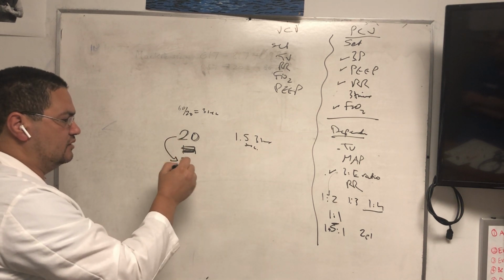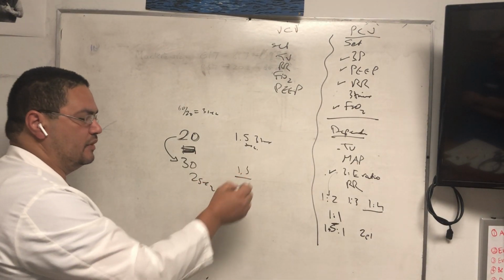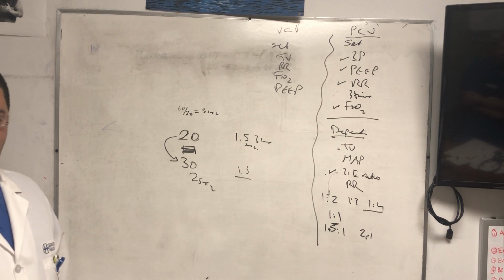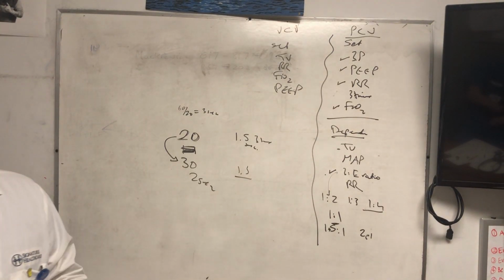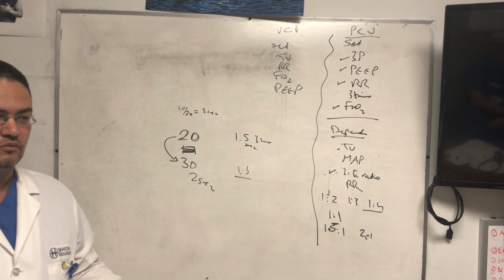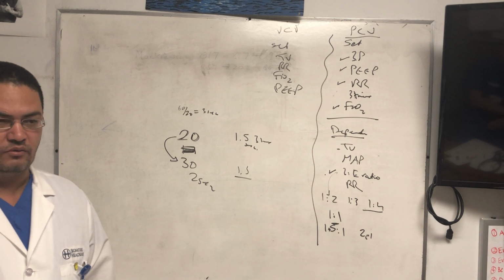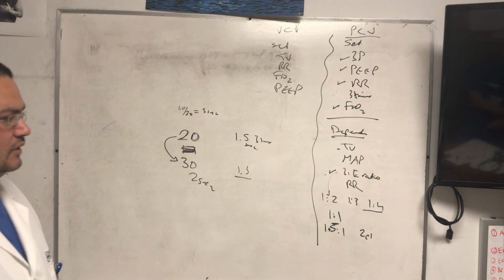If the patient goes to 30, breathes at 30, what's going to happen? He now has 2 seconds per breath. 1.5 of them will remain I time, and only half a second will be for the E time. So the patient will have auto-PEEP, pop his lung, get discoordinated with the vent, and get very mad at you, right? So that's why we order the I to E ratio. The respiratory therapist visits the vent, checks the vents every 4 hours, or PRN, and whenever he finds that the patient is breathing faster, he can calculate again and make the I time 1 second. Or if he finds the patient breathing slower, he'll prolong the I time, and he keeps changing the I time. But that's for safety.